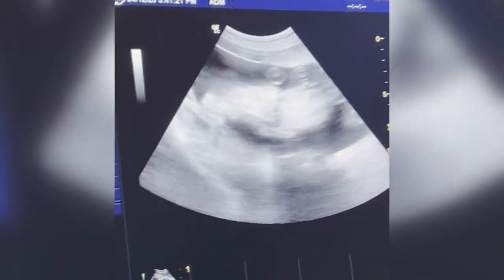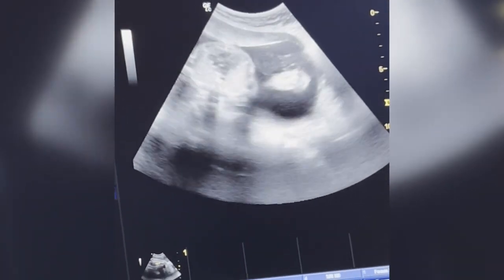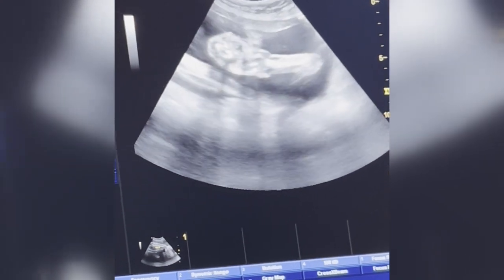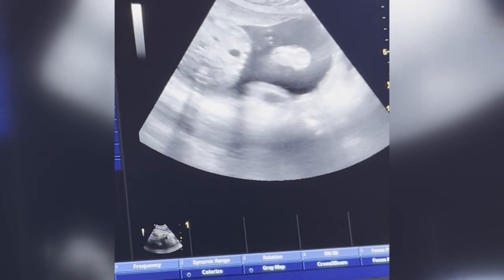I'm putting a little more jelly. Visualize nicely. Now leg is displayed and we want to display the femur. It is the femur bone. We should confirm, is it femur or not? We should confirm it.